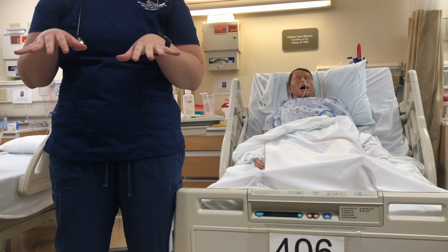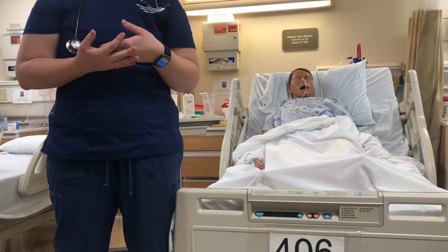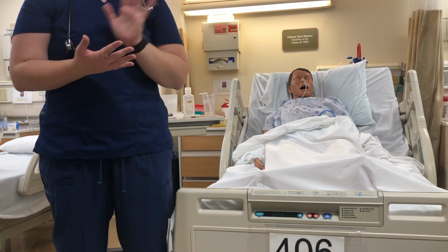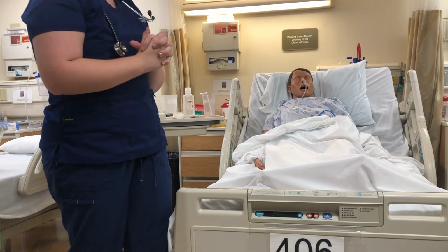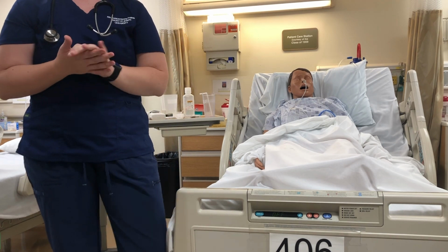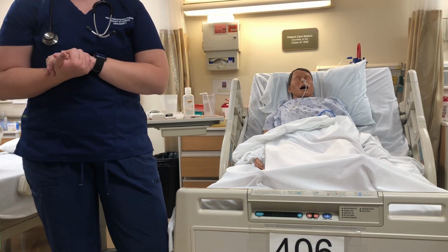I'm going to document in the chart that I placed a Salem sump 14 French stomach tube, NG tube, in the patient. We reached about 64 centimeters in the placement, and it was in the left naris. The patient tolerated the activity pretty well. We are waiting for x-ray, and I will touch base with the patient once we get that chest x-ray.